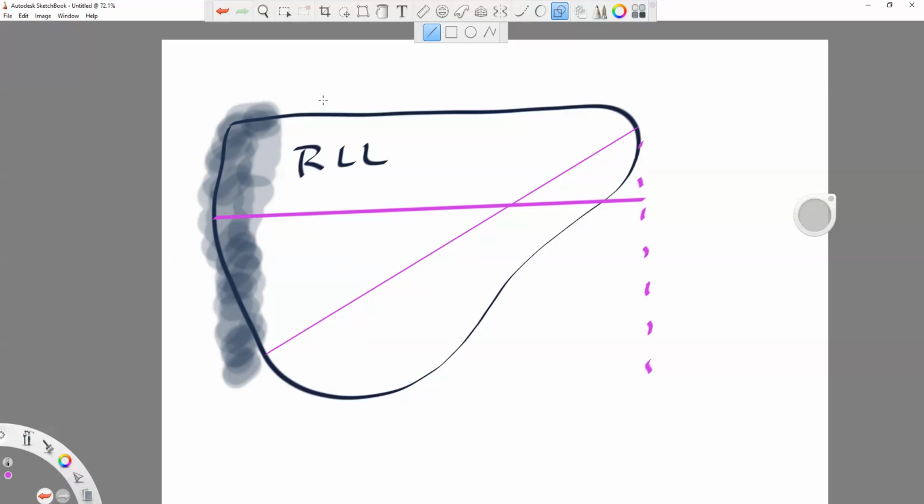In order to get this picture, according to Melissa and myself, we like to see the right kidney in long.